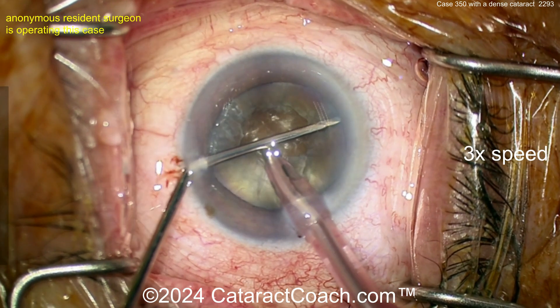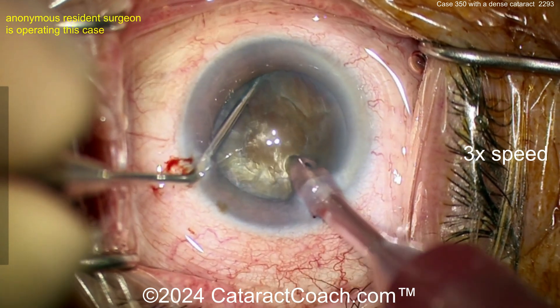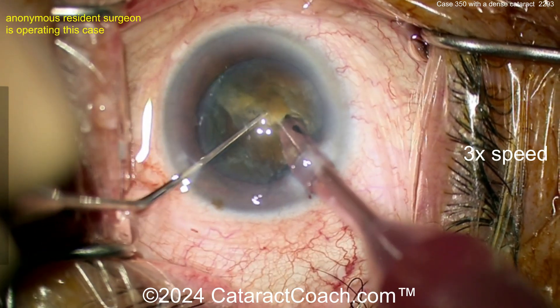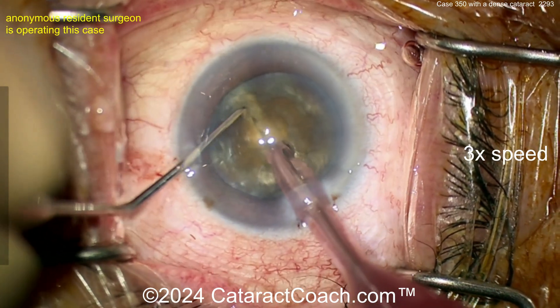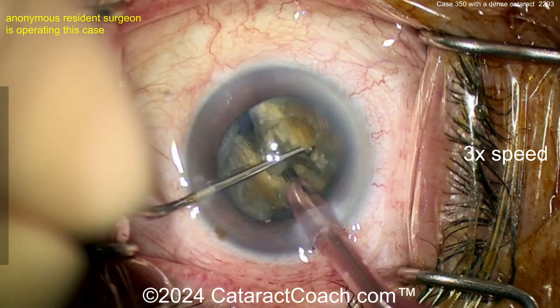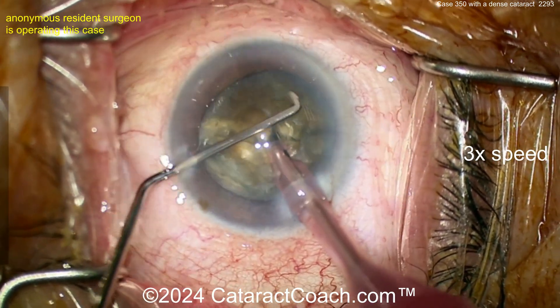Chopper going in — looks like a nice sharp chopper, maybe doing a horizontal chop technique. Place the chopper on the other side of the rhexis, buzzing with the phaco probe, and get that chop going. That's dense — look at that. Pull apart — it may not even want to go. That's okay, just buzz again and do it again. Look at that propagating crack. This dense nucleus is kind of fibrous — see how the pieces don't want to fully split, they're still kind of attached. Rotate a little bit more and try again.